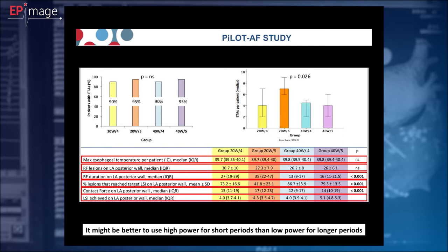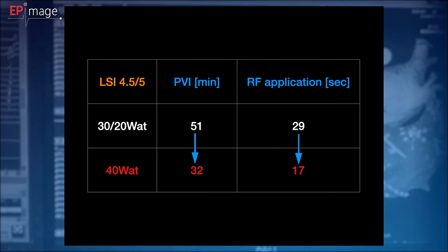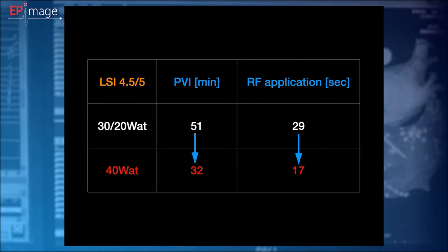So still in 2017, after coming back home from Europe, I started to use 40 watts on posterior wall and in other regions, and you see here the results of first 15 patients, how time of pulmonary vein isolation and time of single radiofrequency application shortened.